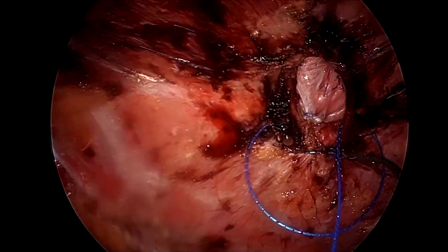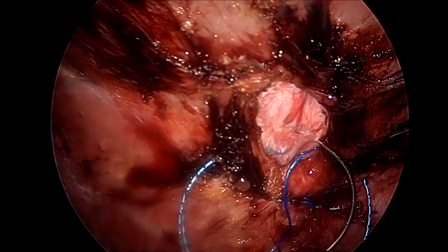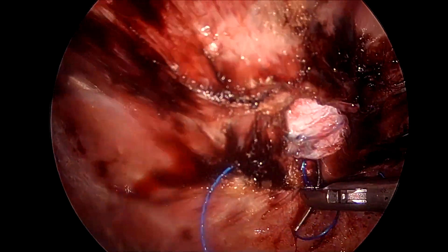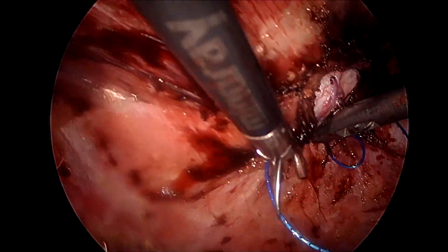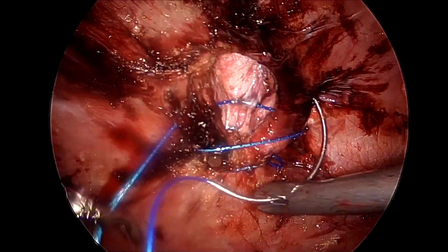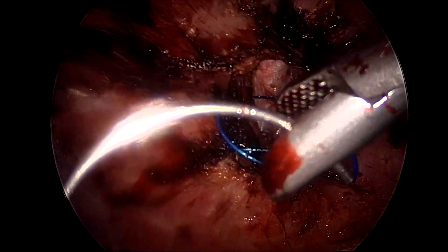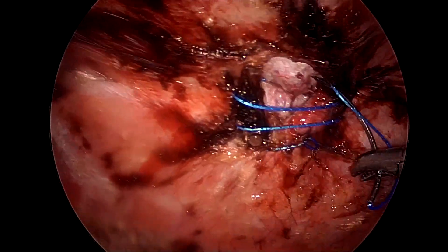We reduce the pressure once we have taken a few bites and are approximating the sutures. We take a couple of bites first, then after taking three or four bites we pull the suture completely to close the hernial defect.